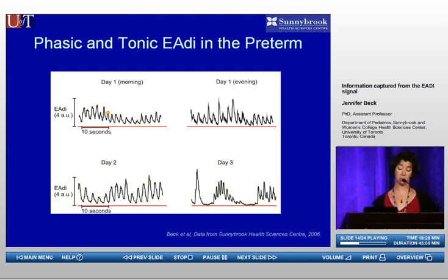So you have phasic breathing, where the signal goes up and down, which is variable from day to day. But you also see that with this background diaphragm activity, the signal doesn't go back down to baseline or to 0. The background diaphragm activity is actually also very variable. So you can see here, there's a very large amount of tonic activity compared to, let's say, over here. You'll also notice the presence of sighs, where the babies take very deep inspirations. And then you also have these periods of apnea that can vary in length anywhere from 2 to 3 seconds up to 20 seconds.